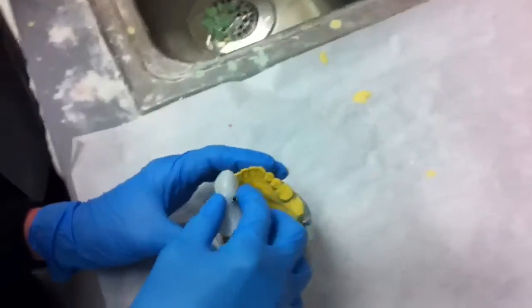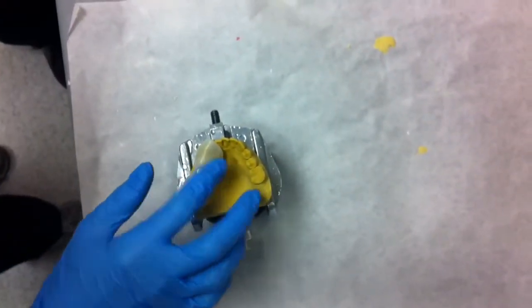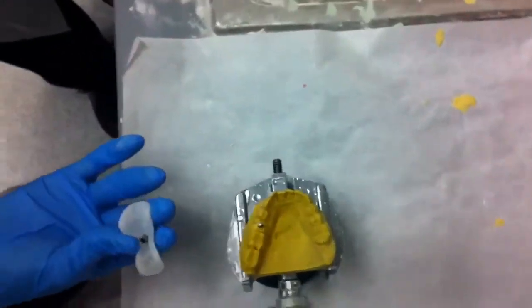Let's put it back down and make sure we're still happy. I think it's happy — I think it worked. Perfect. Now look inside and make sure you can see teeth. That's happy.